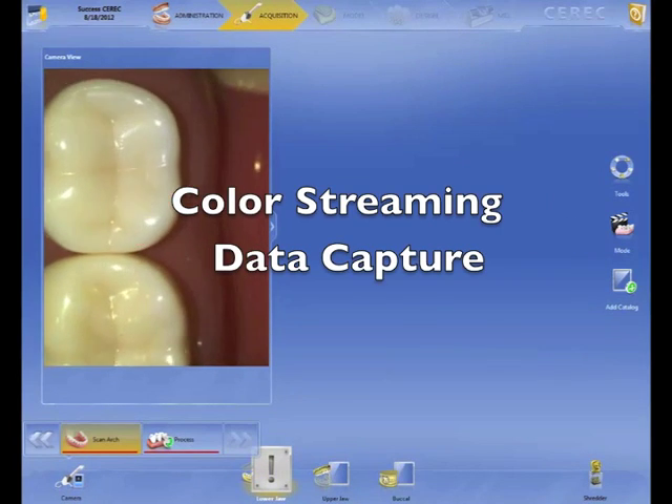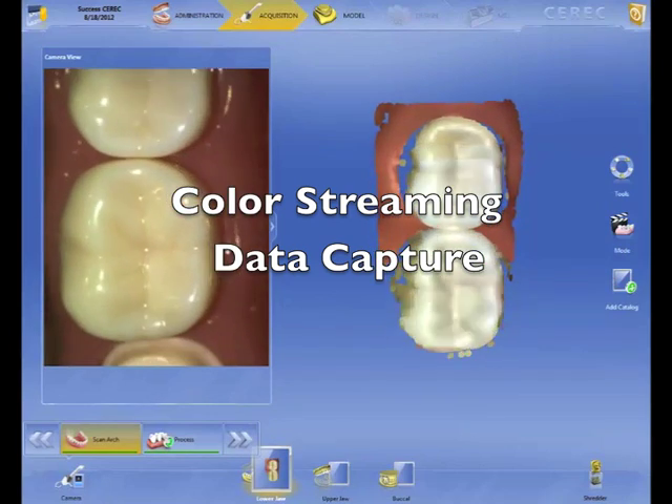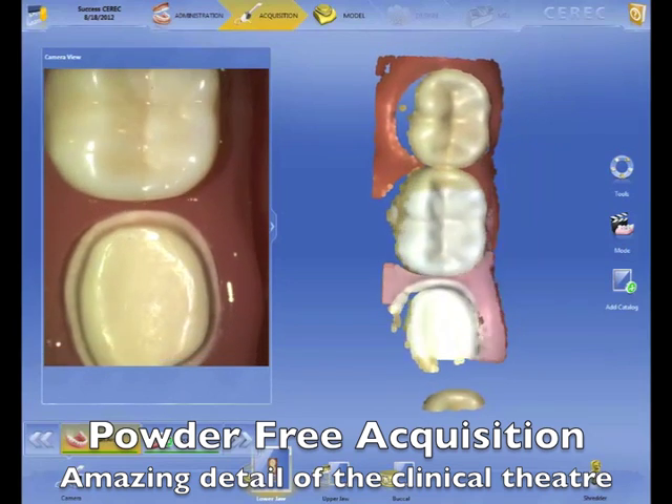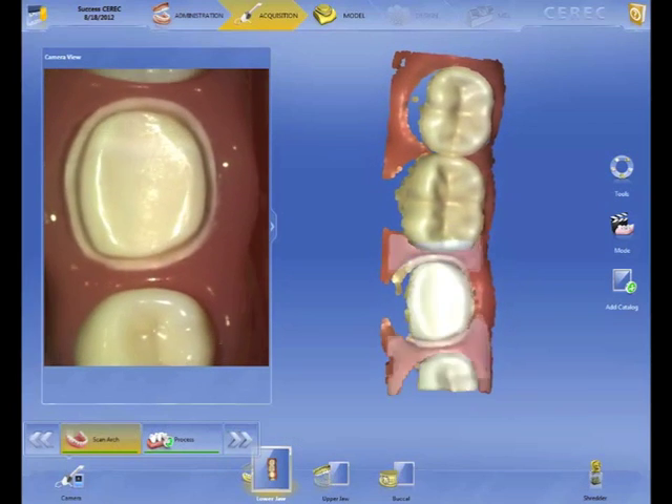So let's start scanning. The first thing you're going to notice here is the sounds — it sounds like a Geiger counter. That's actually something to help guide you on your imaging, the pace at which you're going to image. This is ridiculous how easy this is to image.